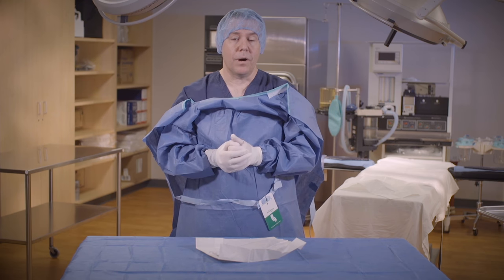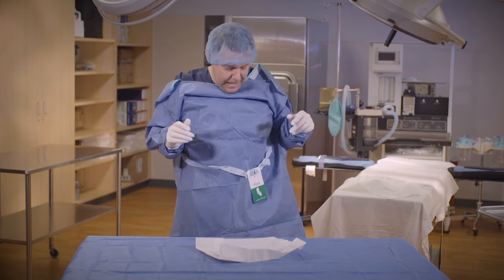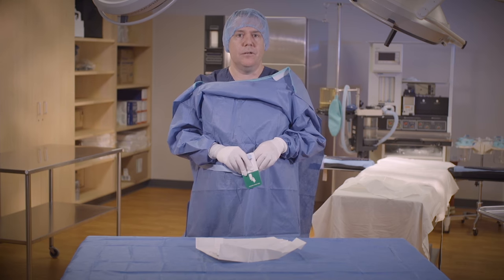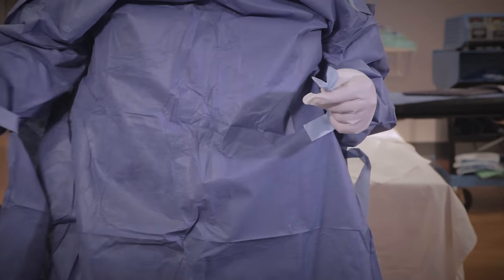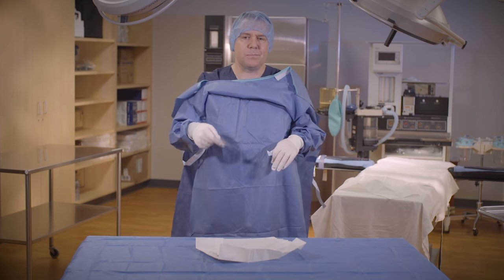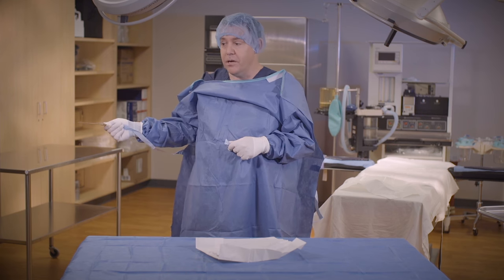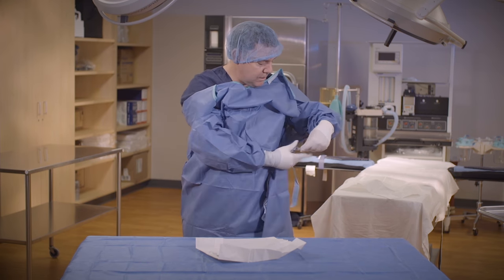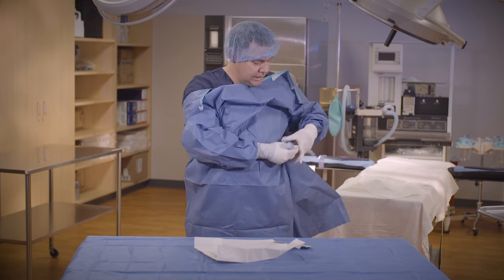Now, lastly, we want to turn the gown. Making sure that the circulator has a firm grip on it, I'm going to grab the tag with my right hand and grab the tail with my left hand. I'm going to pull off with the right, give the tag to the circulator and turn. You will notice that in turning I did expose my back to the back table. So sometimes when I pass the tag off to the circulator, the circulator will actually turn and I will stay centered on the back table. They're going to pull the tag off, hang onto it, and we are going to tie the gown.